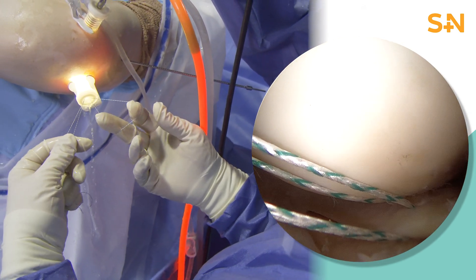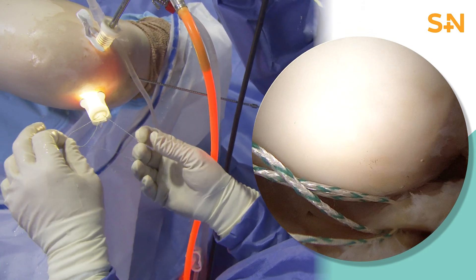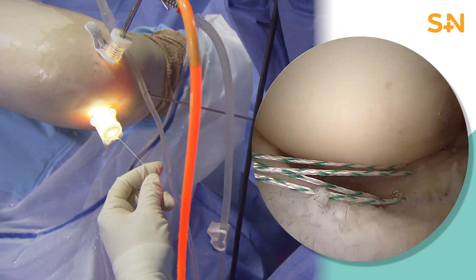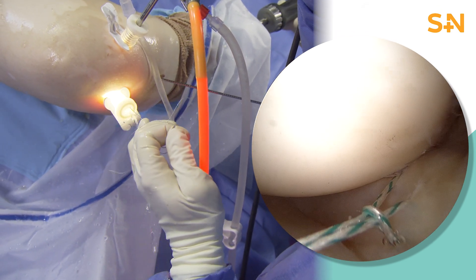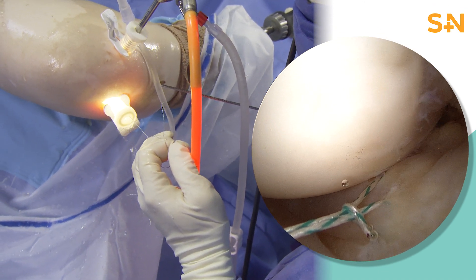We then have passed that loop out of the knee, and through that loop, we are now placing the two sutures that had been placed using the NovoStitch Pro in order to create the modified double locking stitch. This will then pass the loop down into the meniscus, taking hold of that meniscus, providing a very strong grasp and repair of that meniscus in that posterior root.